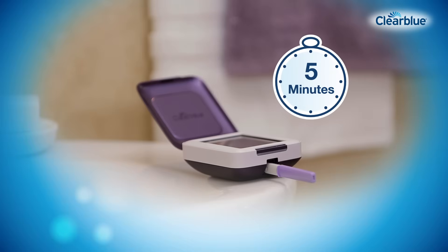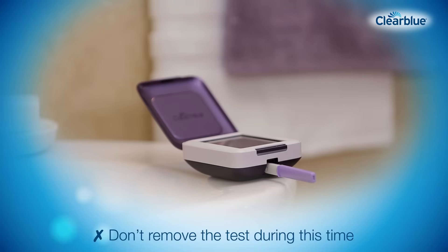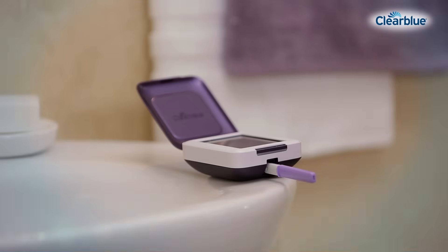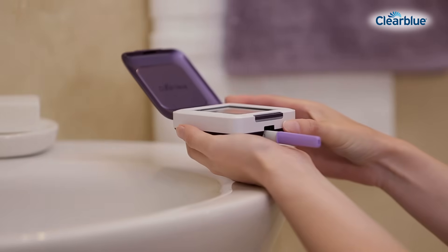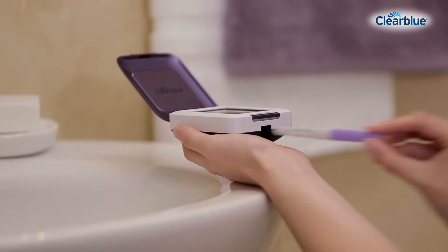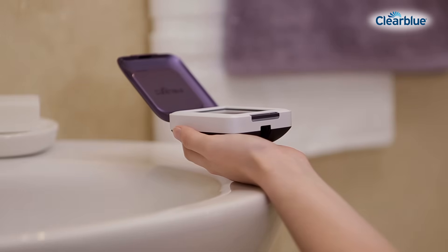Wait five minutes while your result is read by the monitor. The screen will switch off after one minute, but the monitor will continue to analyze the test. The alarm will sound when testing is complete. Switch on the monitor and remove the test stick.